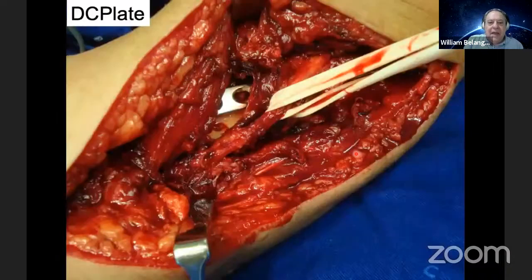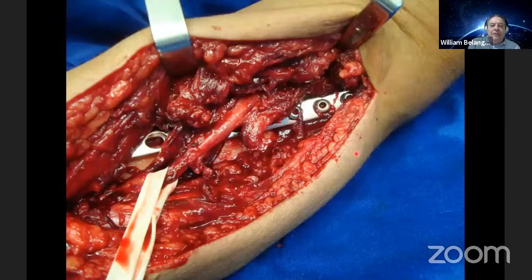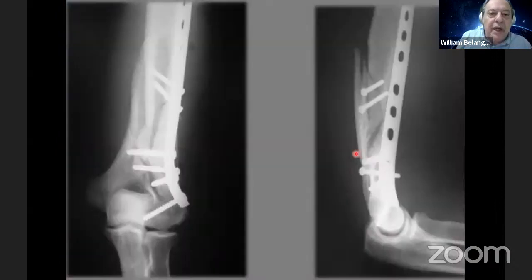Okay, then you introduce the plate, put another screw to fix this part of the metaphyseal fracture. This is the plate inside. This is the radial nerve. Then we fix the plate with 3 distal screws and 2 proximal screws, like I show you. Okay, this is the final fixation.